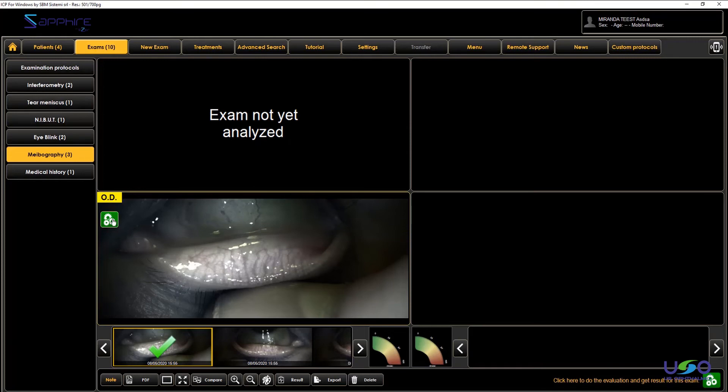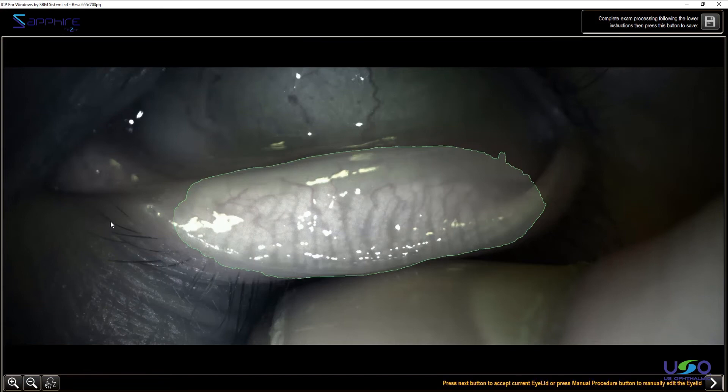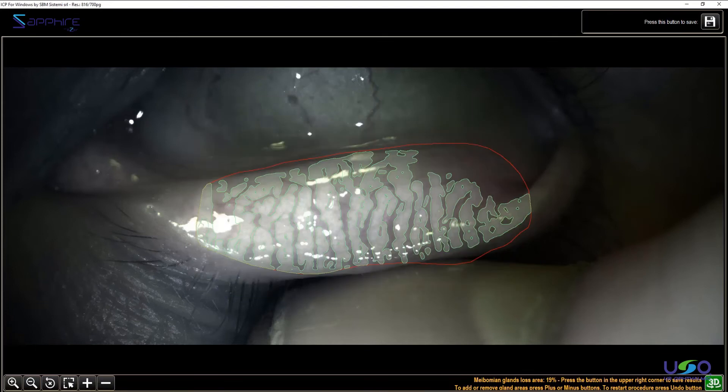How do we analyze it? I can analyze it with the green button, as always. The software automatically highlights the area of the lid, suggesting a lid area — it's fully automatic. If you don't like this detection, you can retake it. You can draw it manually with the button in the lower left corner, and draw by yourself exactly the area where you want to make the analysis. The software detects quite a big loss here — it's saying that 19% is lost.